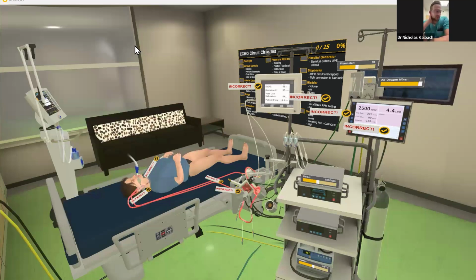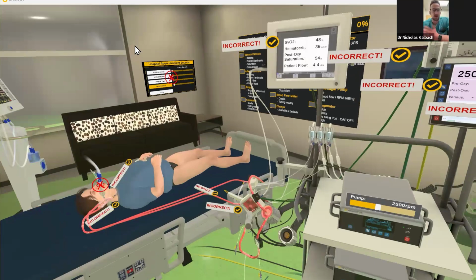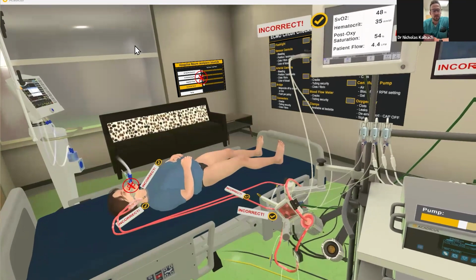So, as we said earlier, there's two forms of ECMO. There is VV, which is veno-venous, which is a form of lung bypass where we drain blood from the venous system, most typically somewhere along or near the right atrium or one of the major vessels. And we return it back into those major vessels, typically closer to the heart, where the heart would be performing the cardiac output for the patient. And with that, the heart and rest of the system would be getting the oxygenated blood from that system and traveling around.